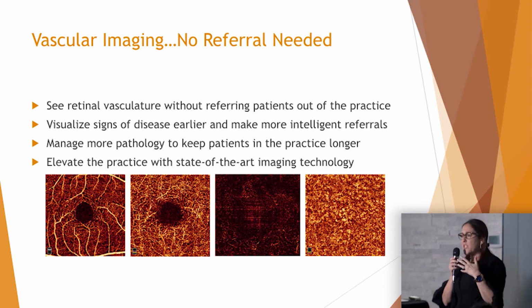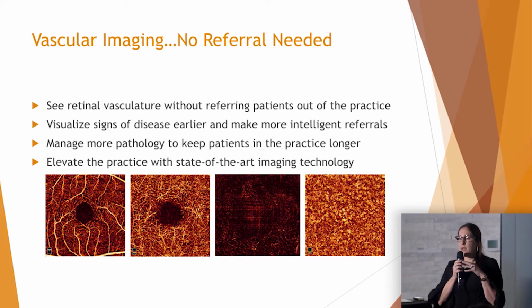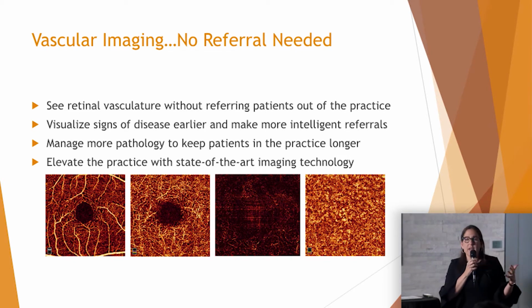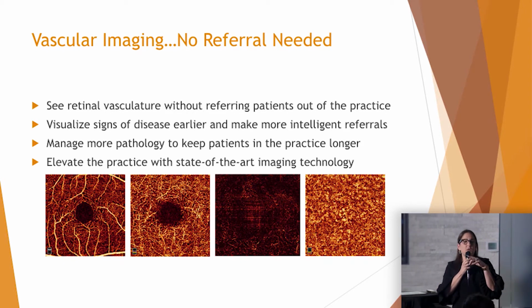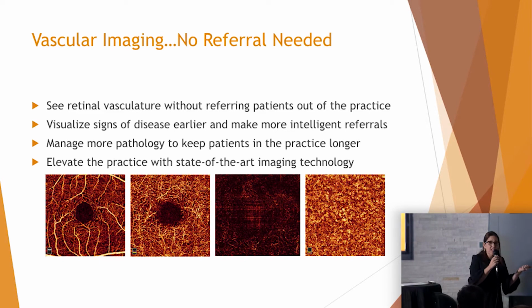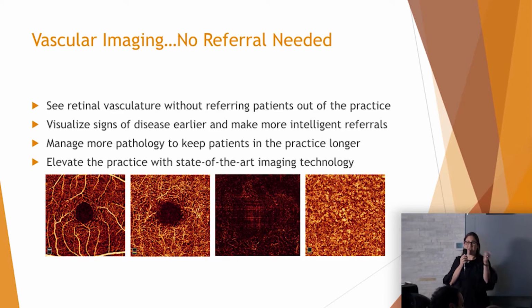How many AMD patients do we see every day where we're running B scans, spectral domain B scans, and we just want more information? They're tricky, right? We're not sure what's going on. This technology is going to give us that, okay? It's going to give us that extra little bit of information that's going to help us to make better decisions, okay? There's going to be patients that we can actually hold on to in our practices longer that we were referring out, and there might be patients that really don't need to be referred out, okay? Or do need to be referred out, and vice versa, you guys get me.